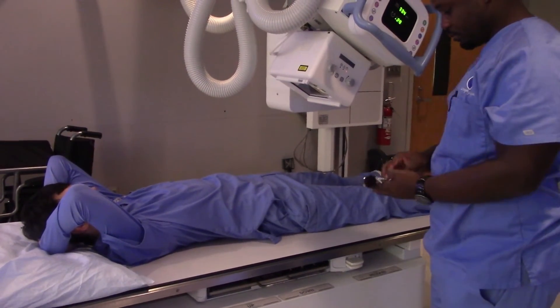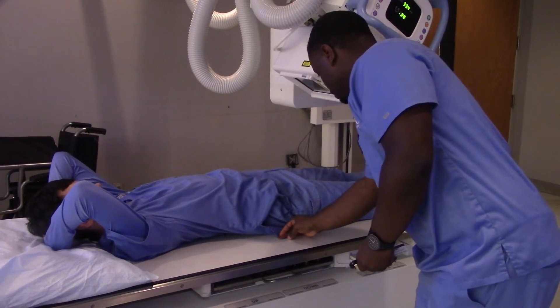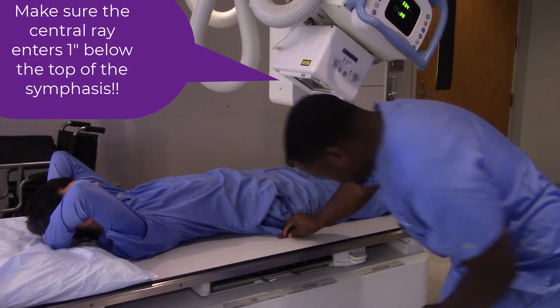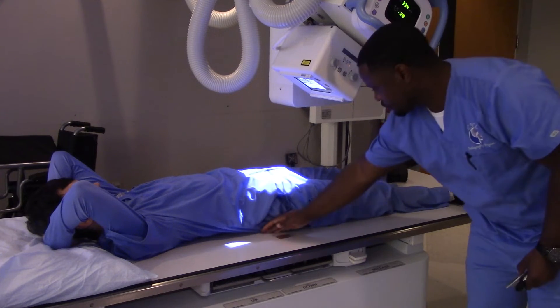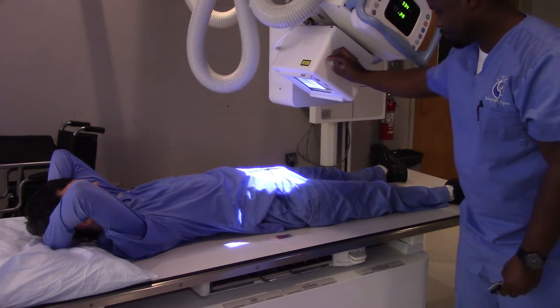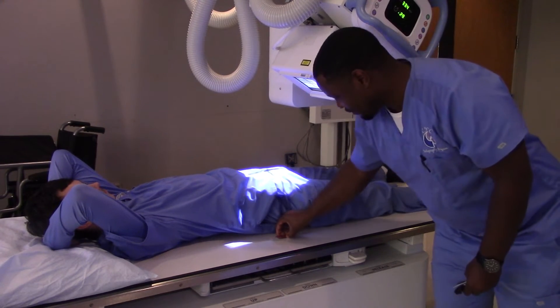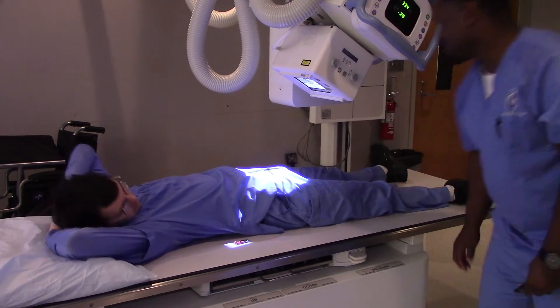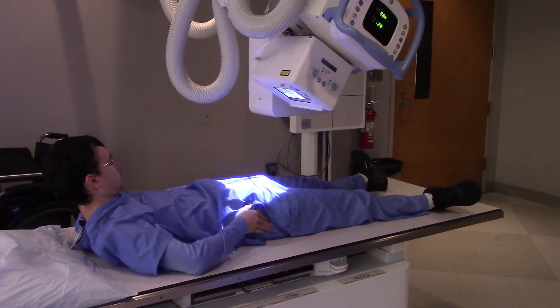We're going to mark this. You can mark the right side because it's closest to us. You can either put your marker on the table or on the image receptor — just try to make sure it's in the white field, because having it outside the white field doesn't always work, as we saw from our experiments earlier. Right there. All right, fantabulous. That looks good.